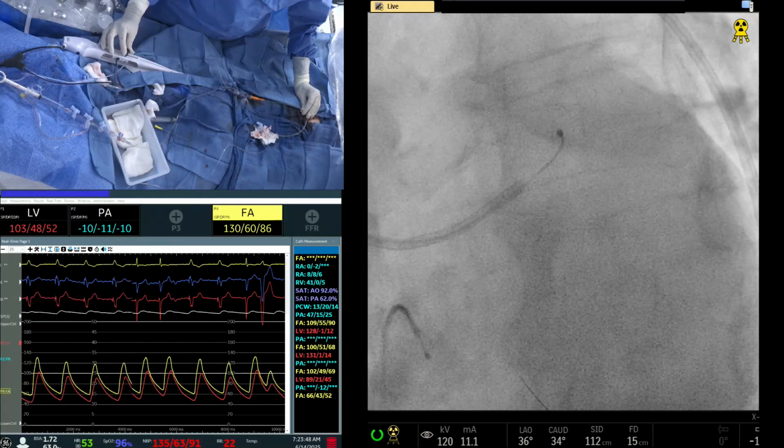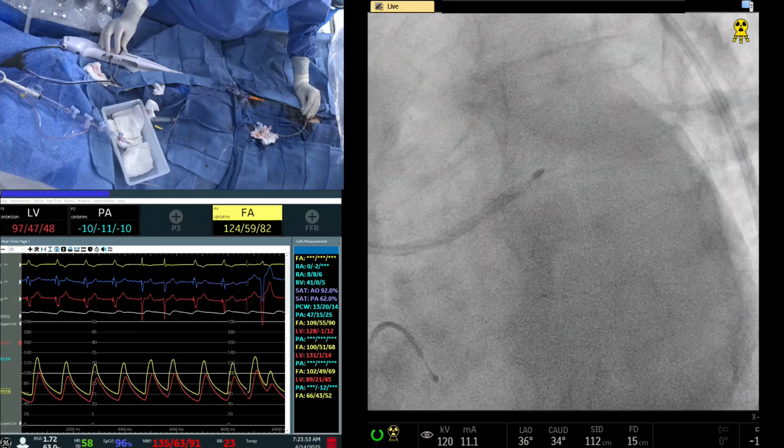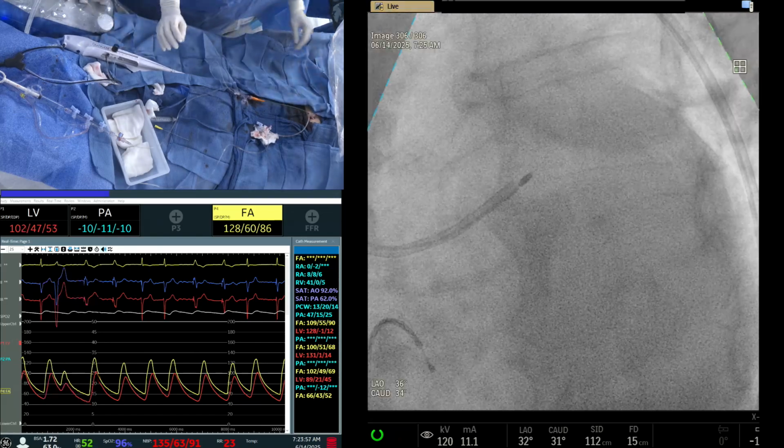You want to take it to the mid LAD also in the epicardial? It's a 1.5 burr. Yeah, patient tolerating so far, so good. And we'll go to the mid LAD lesion or distal LAD lesion now.